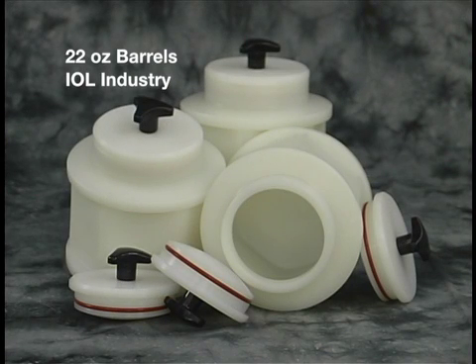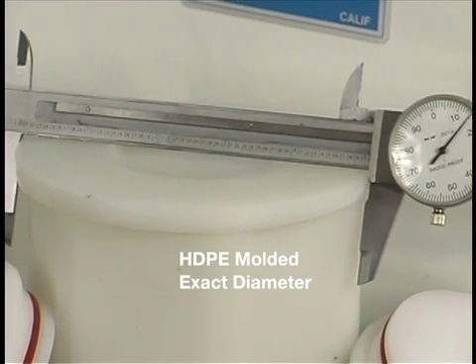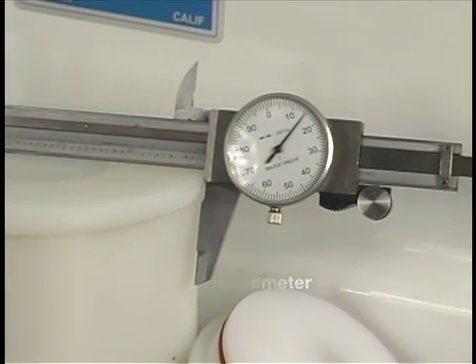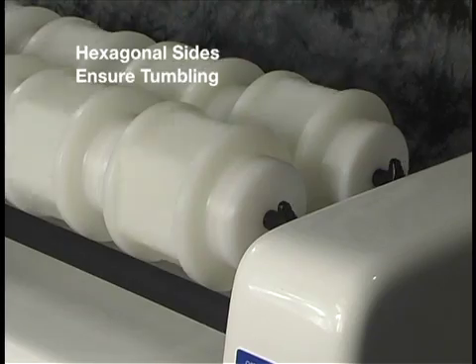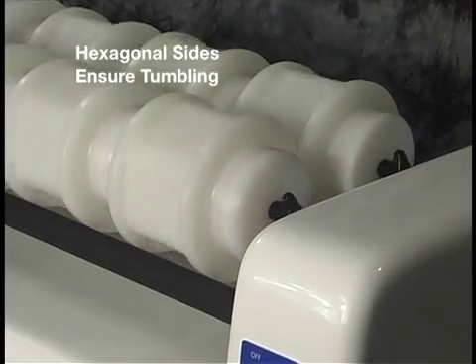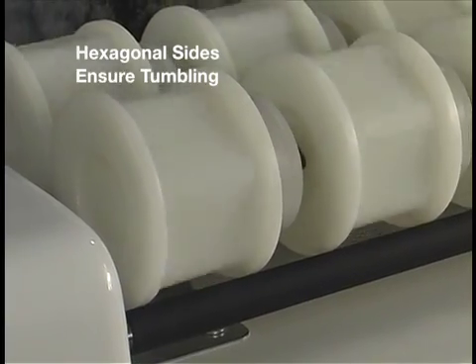We also make 22 ounce tumbling barrels specially designed for the IOL industry. The barrels are molded from HDPE and turned to an exact diameter. They have hexagonal sides that ensure the constant tumbling of the material inside.